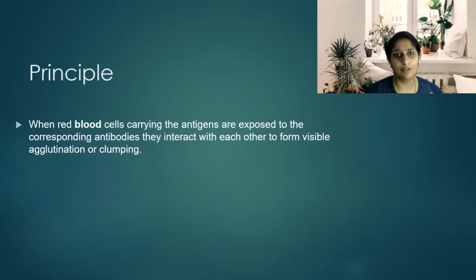What is the principle of blood grouping? An antigen, when it combines with an antibody, causes agglutination. Agglutination is nothing but a clumping reaction.